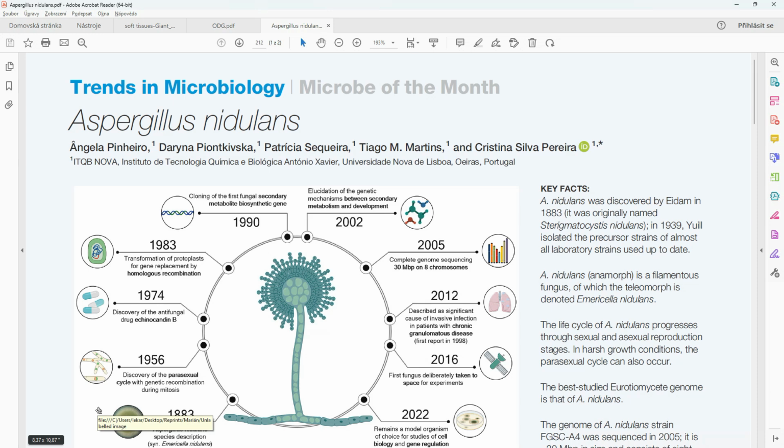Aspergillus nidulans in sinonasal biopsies, as a fungus ball or aspergilloma. Originally, this fungus was thought to be quite indolent, but recently they described even some invasive infections of this kind, so it's not as innocuous as originally thought.